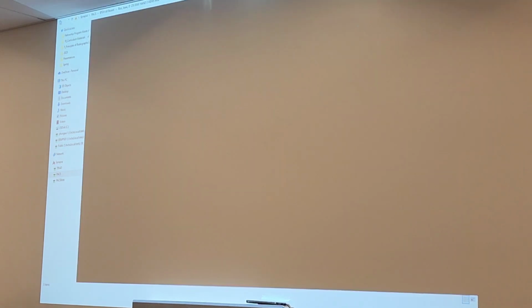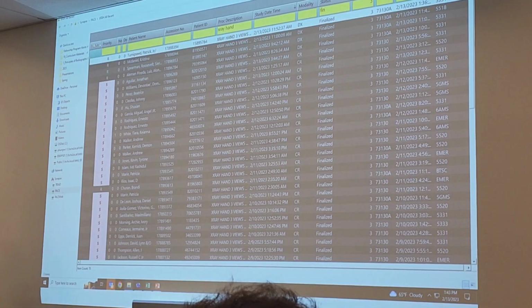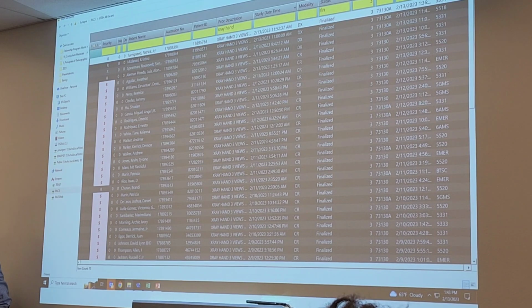Sometimes I see them crop out just the white parts, just because they want to see the image. I asked one time, and they said they don't want to send it to the radiologist like that, because they're sitting in the dark room. That's fair. That's their protocol, as long as it's not a significant change. Personally, I don't like to crop in post, so I just leave it as is. I leave the white border. So that's kind of my proof, my demonstration that this is my actual collimation.